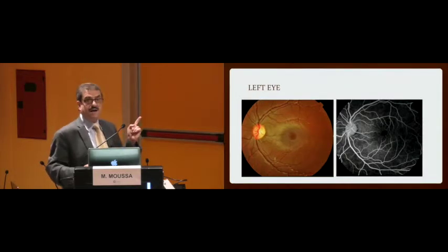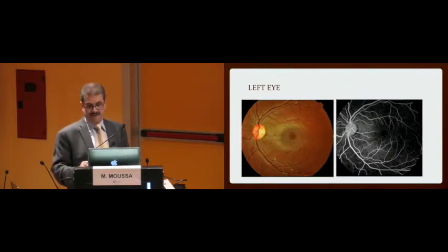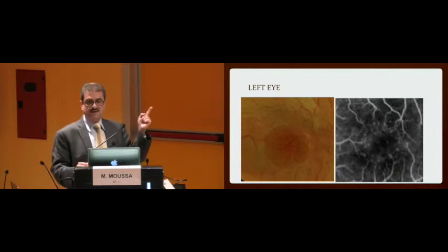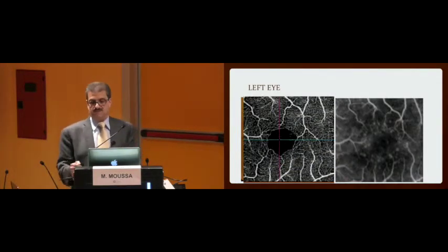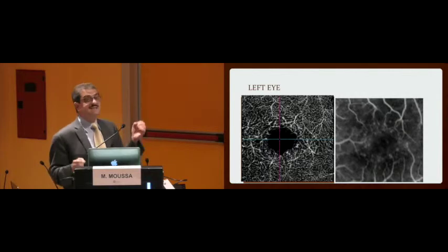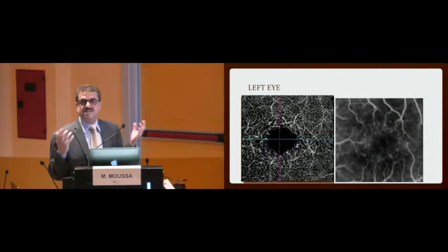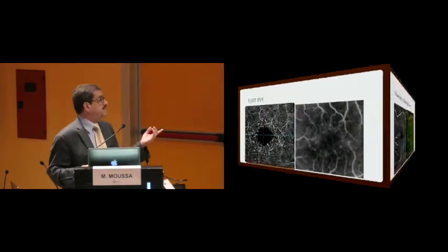And this is the left eye, and this is the explanation of the microcystic changes in the left eye. This is the typical bicycle wheel we see in foveal schisis. This is the picture when I magnified the fluorescein, and this is the superficial capillaries. Nothing at the level of the superficial capillaries. But look at the deep capillaries. The schisis is surrounded by dilated deep capillaries, which is not mentioned in the literature because we didn't have OCT angio to examine these cases of the juvenile retinoschisis.